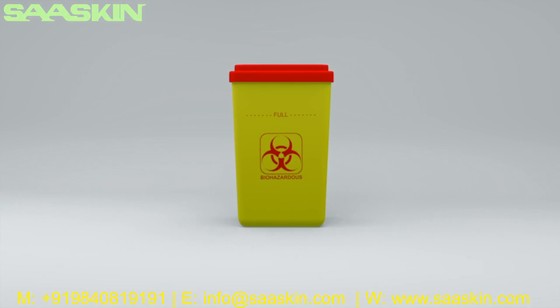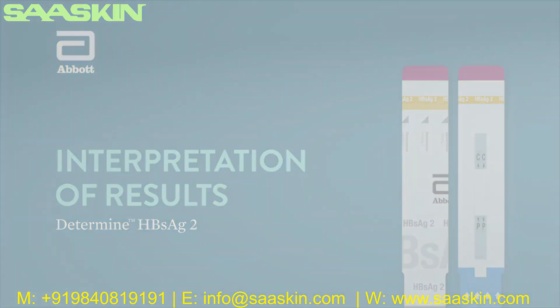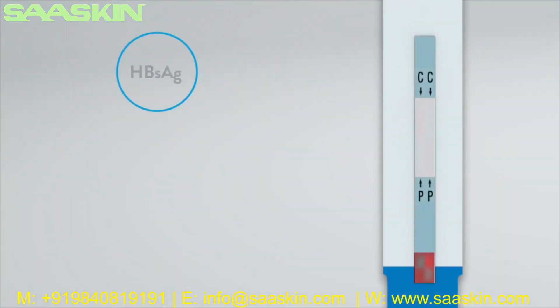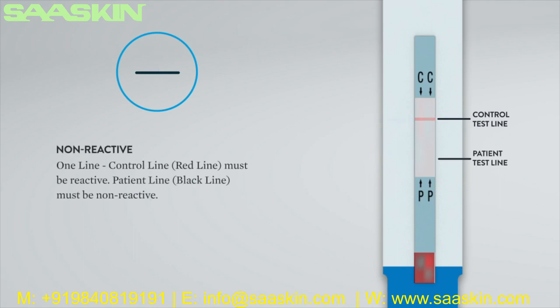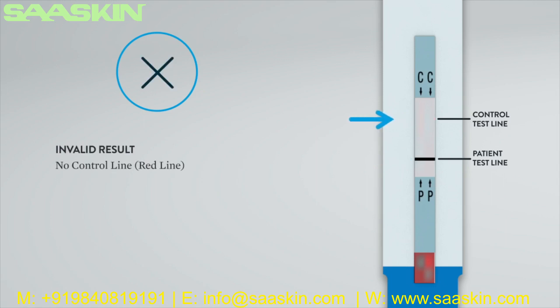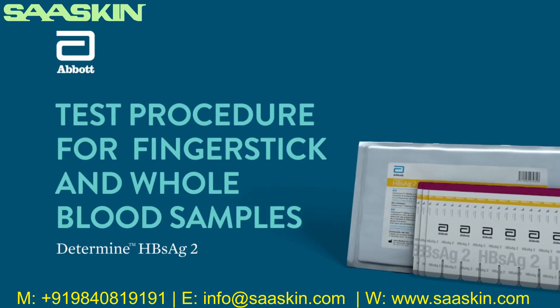Discard the used pipette disposable tip, test units, and any other test material into a biohazard waste container. Interpretation of results: Hepatitis B surface antigen reactive — two lines: control line (red line) and patient line (black line). For a valid non-reactive result — one line: control line (red line) must be reactive, patient line must be non-reactive. Invalid result — no control line or red line. The result is invalid and the test should be repeated. If the problem persists, contact technical support.